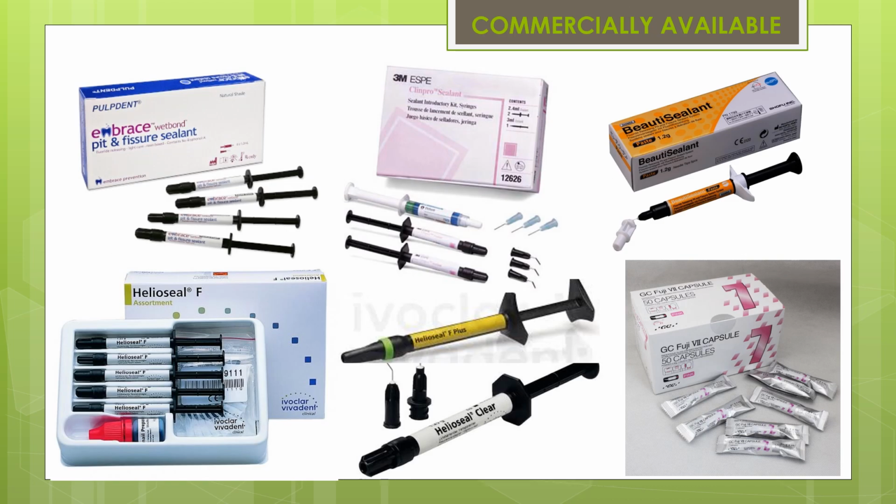So these are some of the commercially available pit and fissure sealants. The first one is Embrace WetBond, and then Clinpro sealant, HelioSeal F, fluoride releasing, HelioSeal Clear, tinted, Prevent seal, and you can also use Type 7 GIC as your pit and fissure sealant.